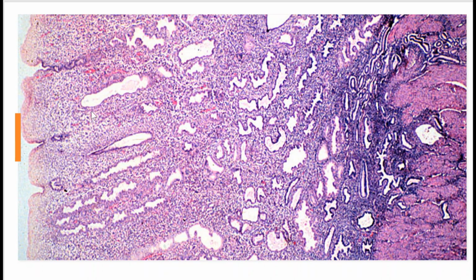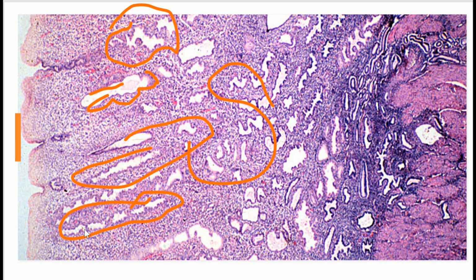This one here, secretory. Because we do have a couple of little ones that look like they could be straight, but they've got some stuff going on up in here. Secretory.